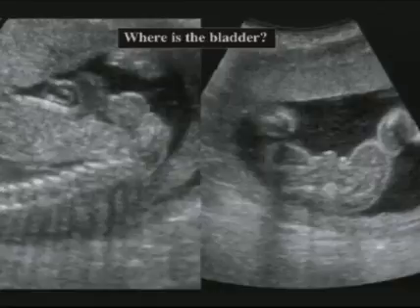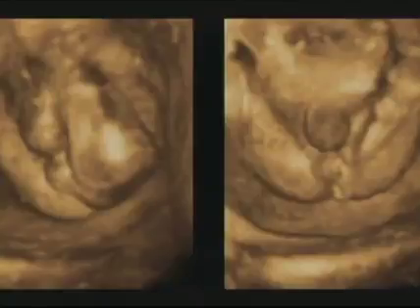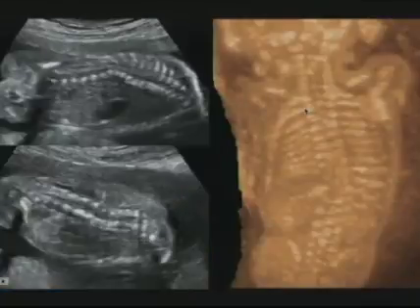Well, one can infer that there is bladder exstrophy in this case, because the bladder not being filled is probably lying on the anterior abdominal wall. But what better to show that than a 3D ultrasound? And here on the surface of the anterior abdominal wall is in fact the bladder, which is splayed open in a bladder exstrophy right here. And this was in fact very helpful.